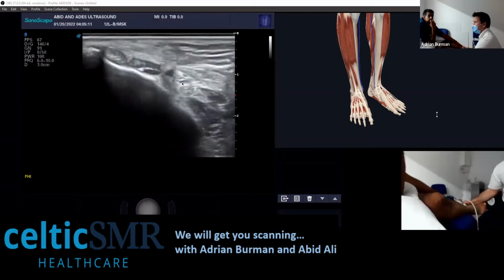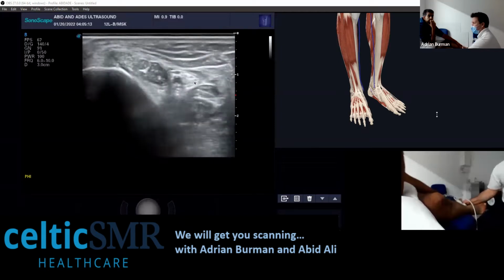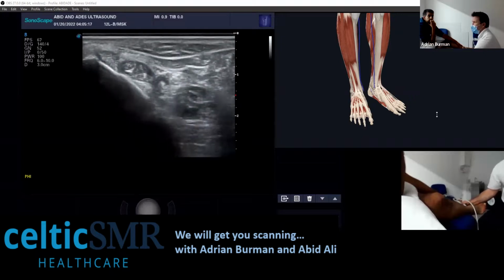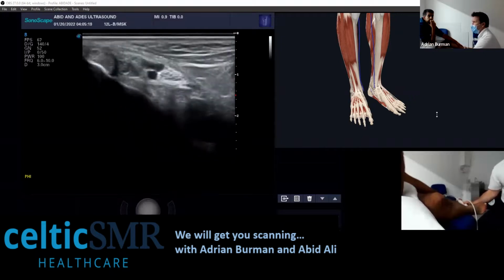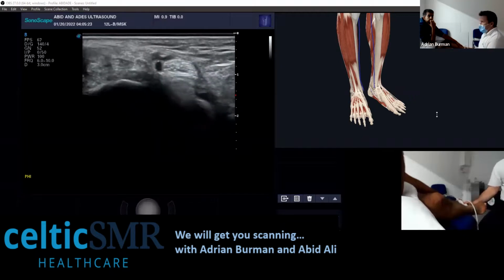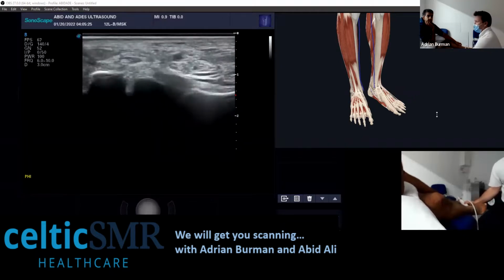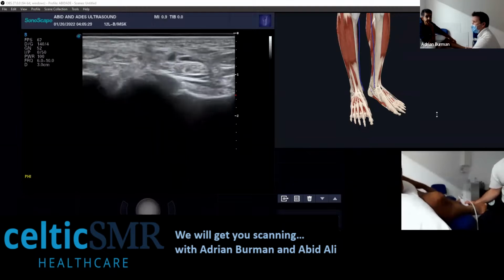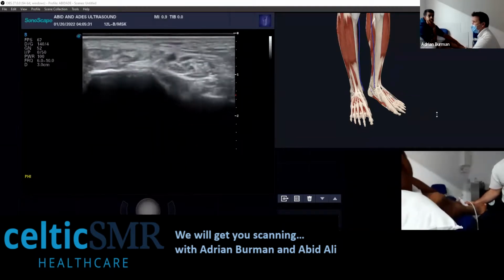So there's your nerve. And I just basically look for any sort of compressive neuropathy within the tunnel, any ganglion cysts or anything like that.